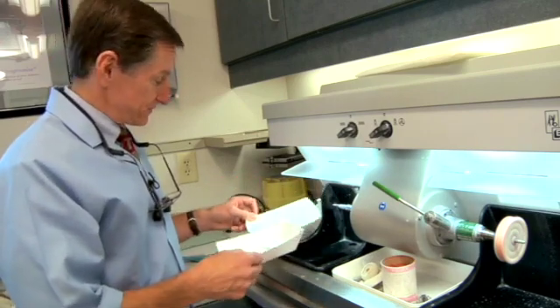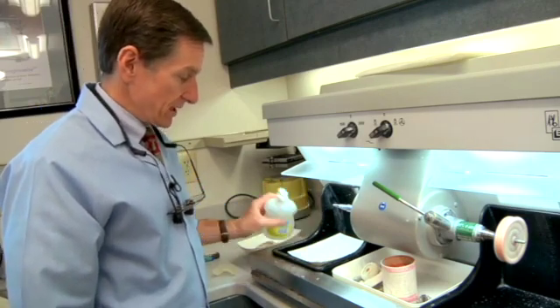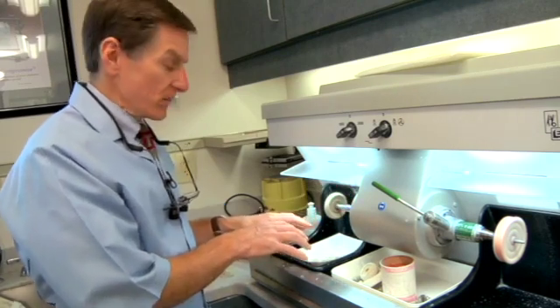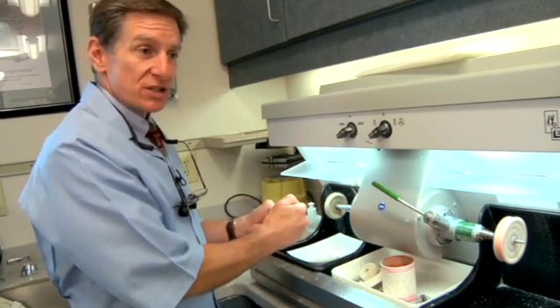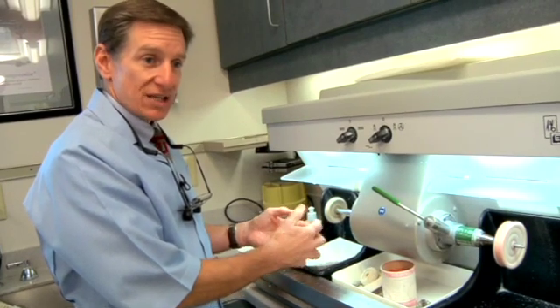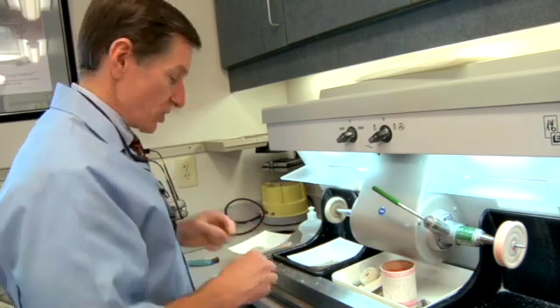It's got clean pumice. I put it down into my lathe, and we have a little water container that I can wet my pumice with. I'll wet my rag wheel, and then we'll put that rag wheel on, and now I have the confidence to know that my pumice is clean, my rag wheel is sterile, and if I'm going to polish a patient's denture that's been in their mouth, I'm not going to take another patient's denture and come polish it on the same wheel with the same pumice. That would be a cross-contamination problem. So this is an easy way to have some little disposable change-out pumice holders in your lathe.